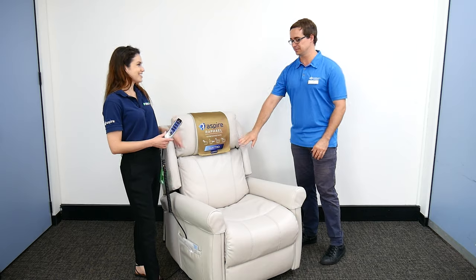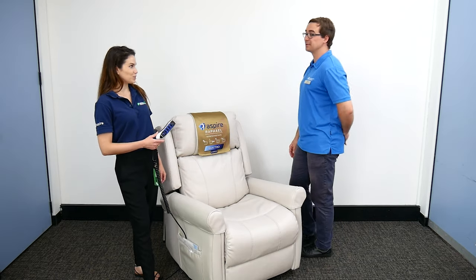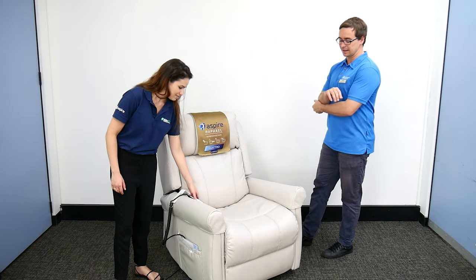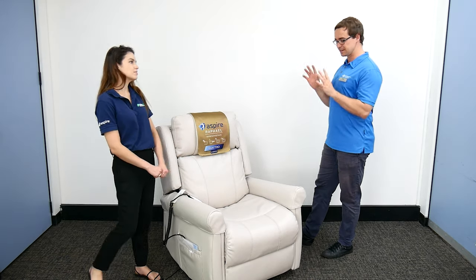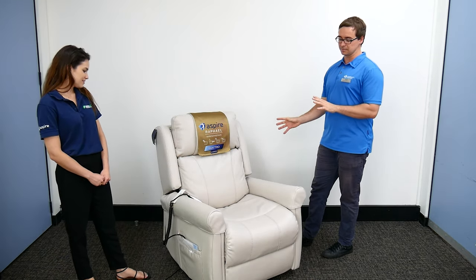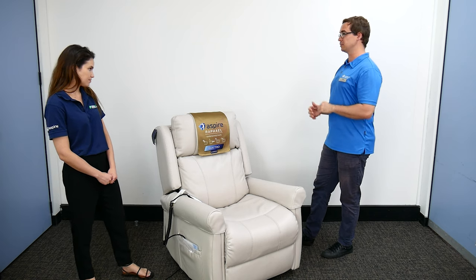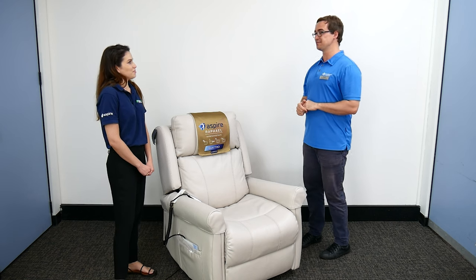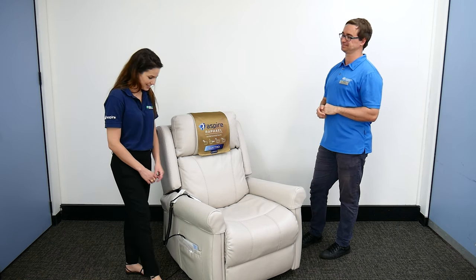The headrest moves, and there's lumbar support as well, so there's lots of movement. An OT — an occupational therapist — loves that because of the ability to customize postural support and get people really comfortable. What's a disadvantage of the four motors?